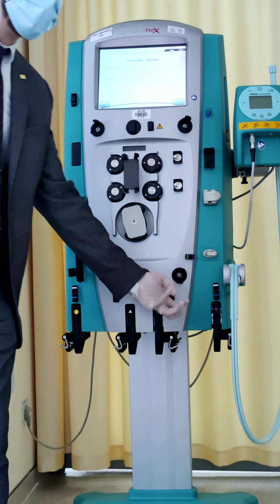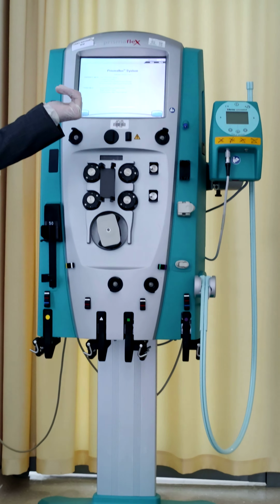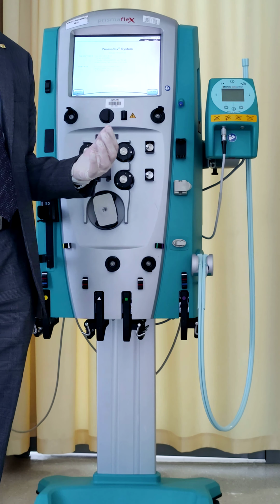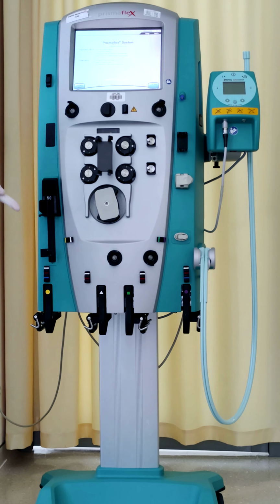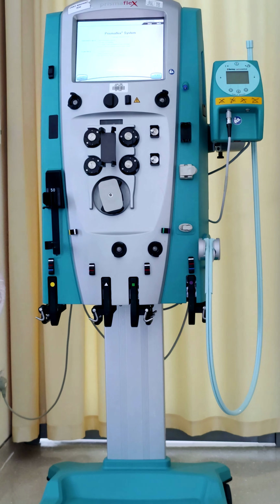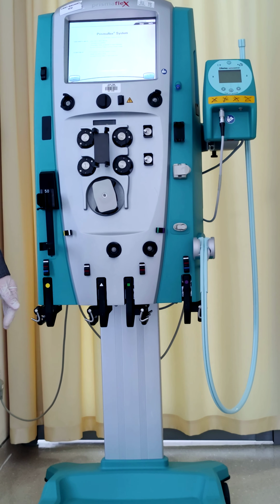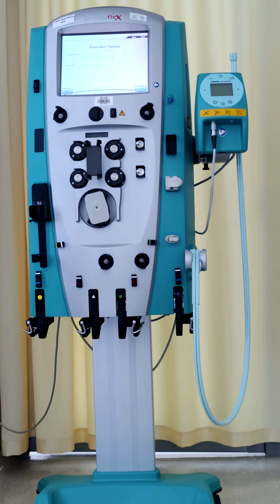If you will hang only 250 ml, you have to inform the machine 250 ml. If you are using 200, you have to make it 200, because it's a small amount and the machine is very sensitive. I have to give it the correct volume to calculate, to know if there is any deviation or difference, and the machine will give us an alarm. If the bag is 240 ml, we can put it 235 or something, because before air is going in.